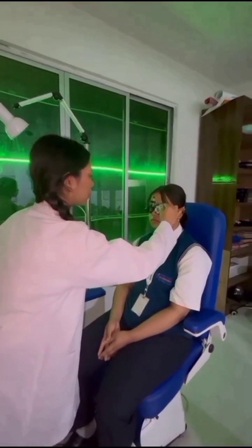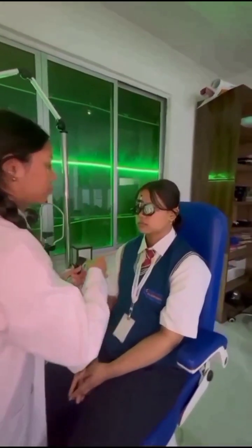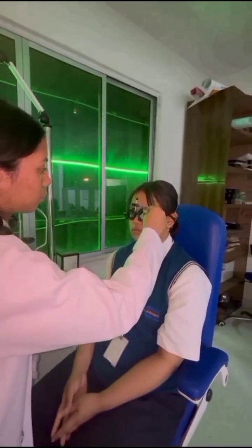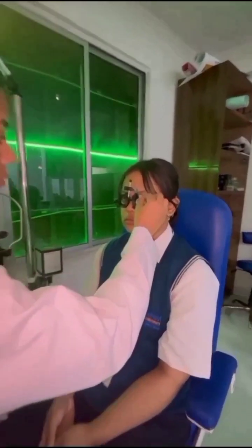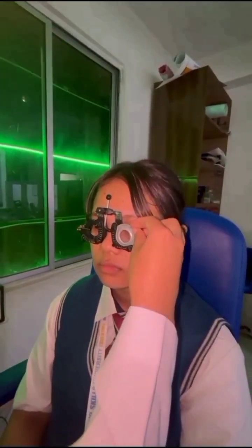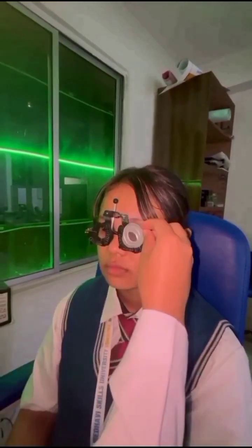So the spherical power is neutralized, and now I am putting the cylindrical lens for the astigmatism, and I am aligning this lens to the axis. There are two axes, one is 180 degrees and another is 90 degrees.